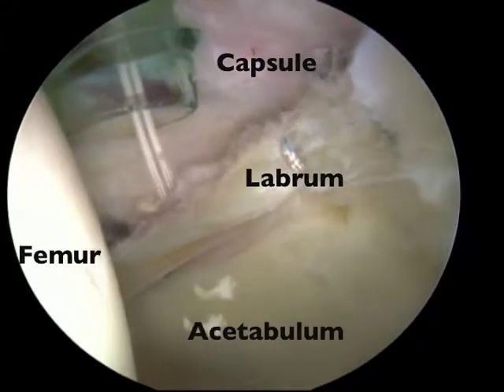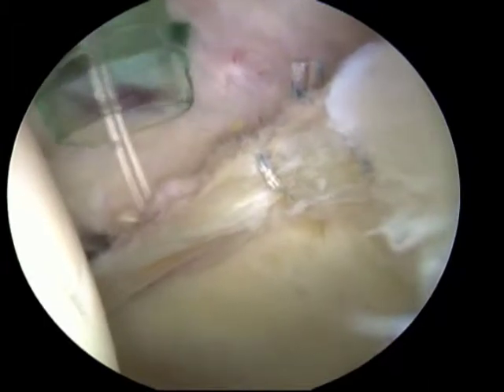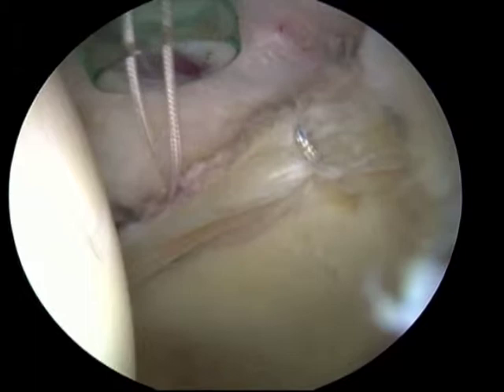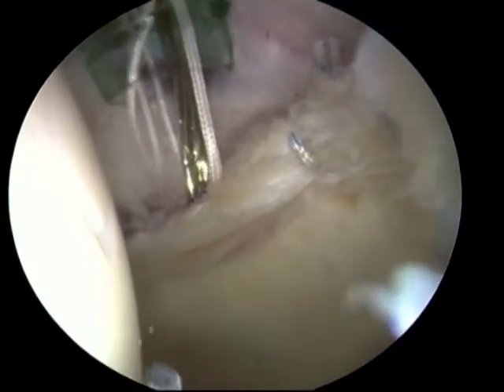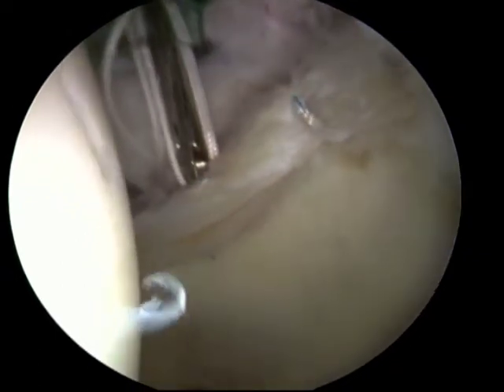During this portion of hip arthroscopy, the labrum is repaired to the acetabular rim. Two anchors have already been placed towards the right upper end of the screen and the suture passed around the labral tissue can be seen. The suture strands are seen coming out of the third anchor, which already has been placed in the bone.